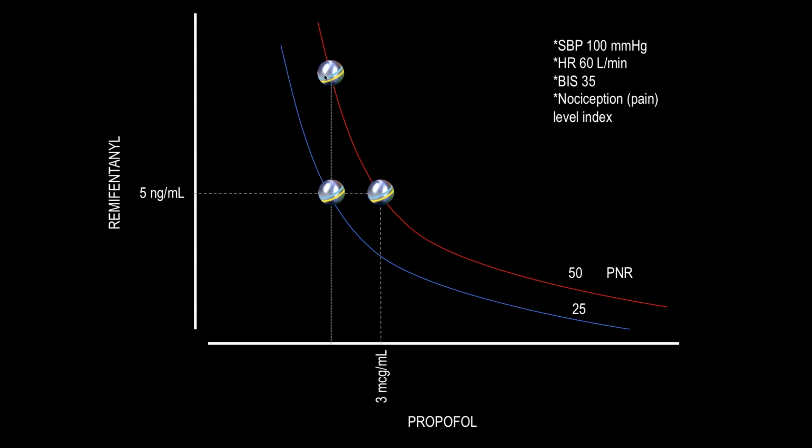So far, the available software has a representation of the synergic interaction curves in 2D, and they overlook the construction of the 3D surface model, where there is a clearer representation of space and time. It should incorporate the PNR as an objective variable, with the possibility of selecting a desired point in the surface model, and based on this point, calculate the concentrations and infusions needed to reach this goal in a certain time. It is a challenge and a need in daily practice.